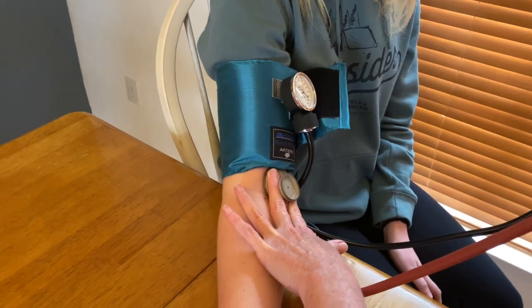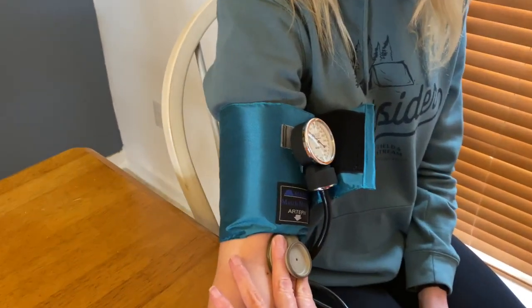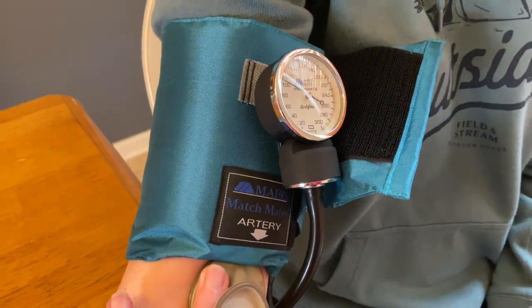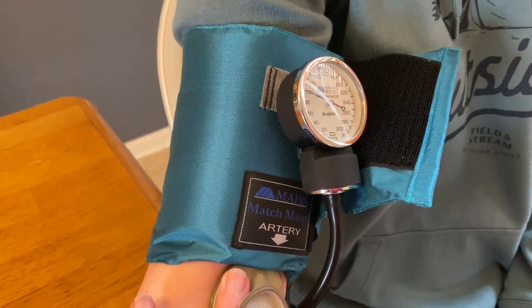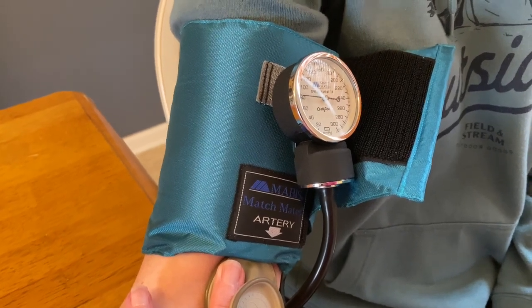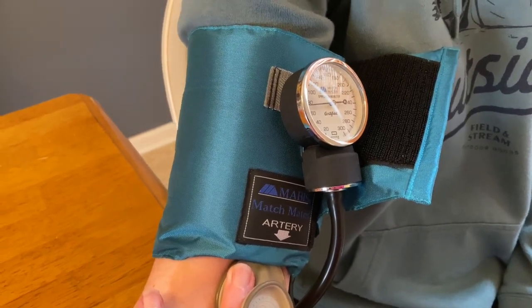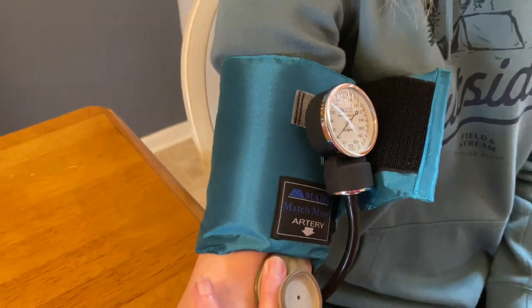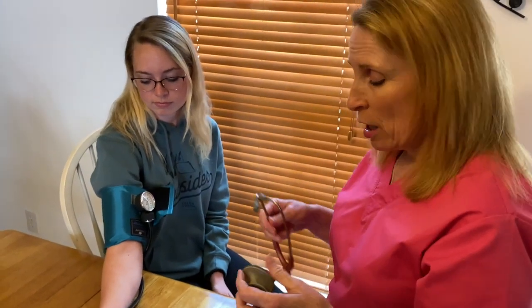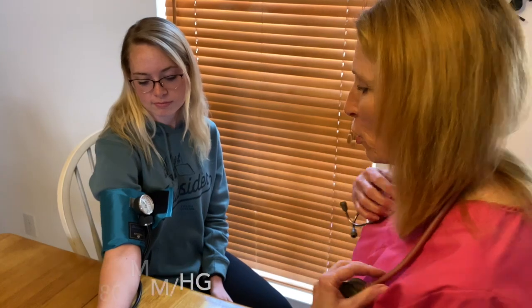And I'm waiting to hear the first sound. And then the last sound. And then release it completely down to 0. And I got 124 over 80 millimeters of mercury.